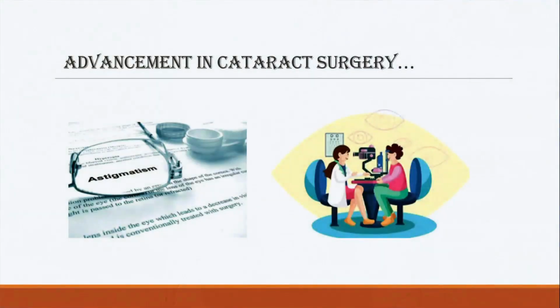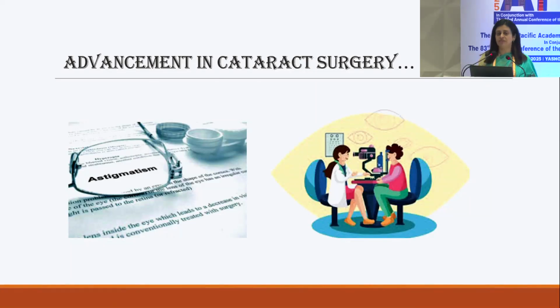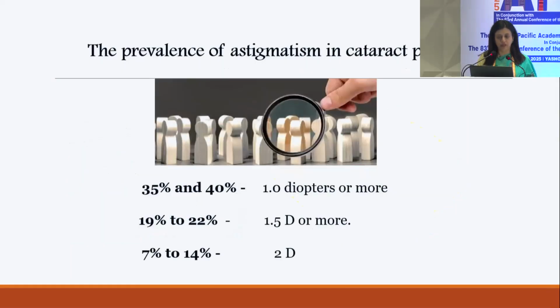Today I'll be talking on a very innovative technique, that is Dr. Boramani's Customized Incision Cataract Surgery. In recent years, the advancement in cataract surgery has really raised the patient expectation of visual acuity and the surgical result as well. And astigmatism definitely has a very important impact on the final visual acuity.